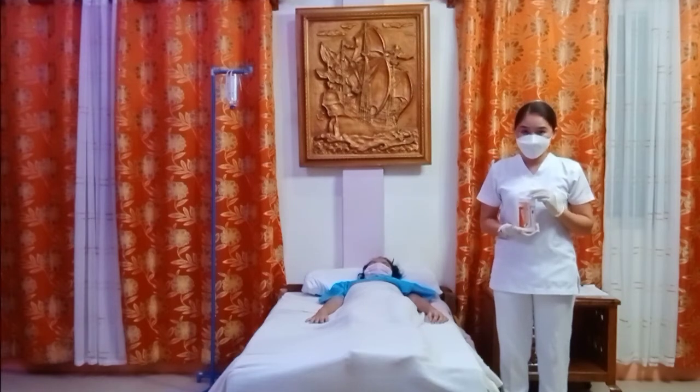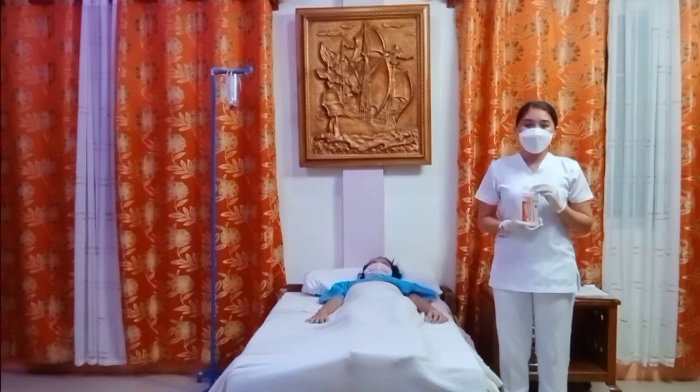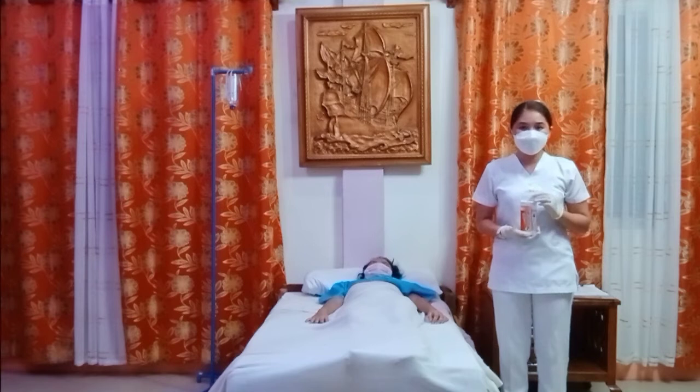As for the tympanic temperature taking, pull the pinna slightly upward and backward for adults and pull the pinna slightly downward and backward for children and point the probe slightly anteriorly towards the eardrum to attain accuracy in temperature reading.